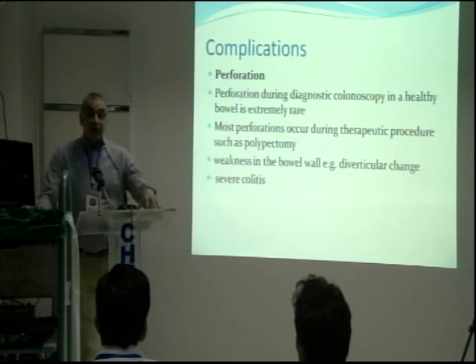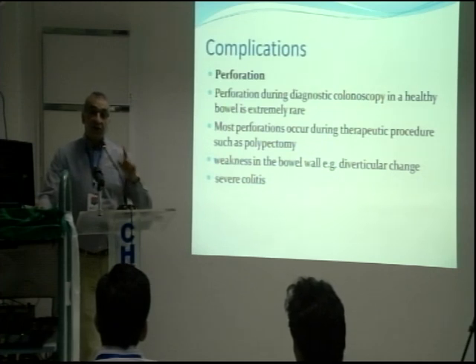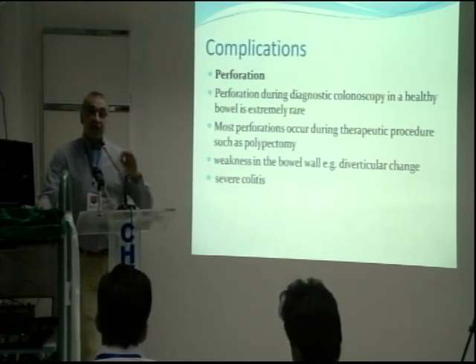If I'm doing ERCP, I would always ask them to stop the anticoagulation, because ERCP is never done as a diagnostic procedure. It is always done with a therapeutic intent. MRCP is the diagnostic procedure of choice. So you have to be very clear in what you want to do, right?